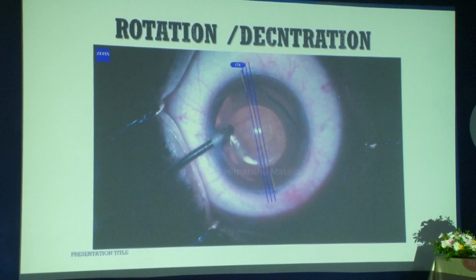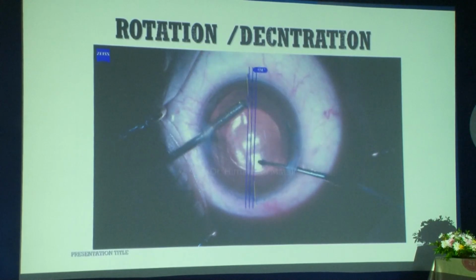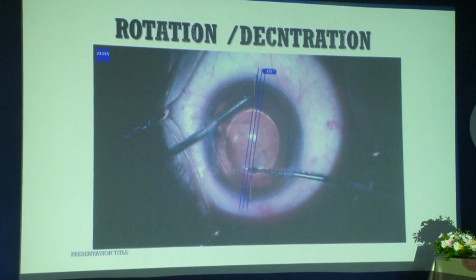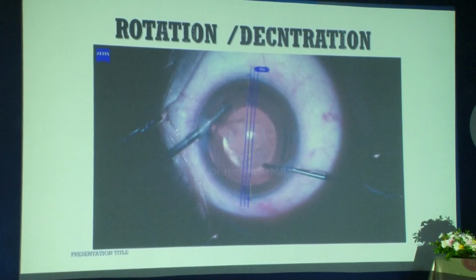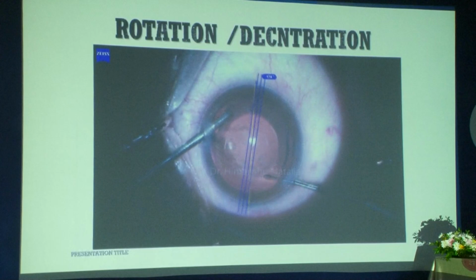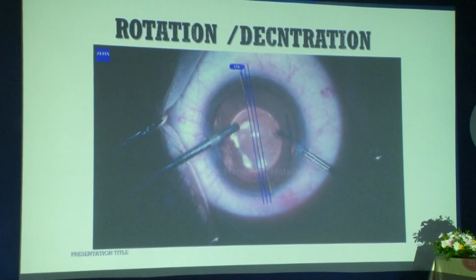You can see intraoperatively itself the lens is shifting, which means that it is a sizing issue. If this one rotates once again, I'm going to explant it. I've decided, but you always hope against hope that maybe this time is the last time and this time it stays. And that's about it.